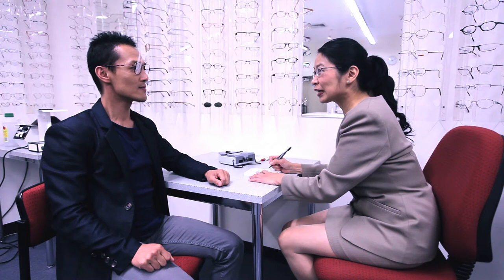With your client's head at the same level, note the point that is level with the center of the pupil. Here the dispenser is engaging the client in conversation whilst assessing the heights.